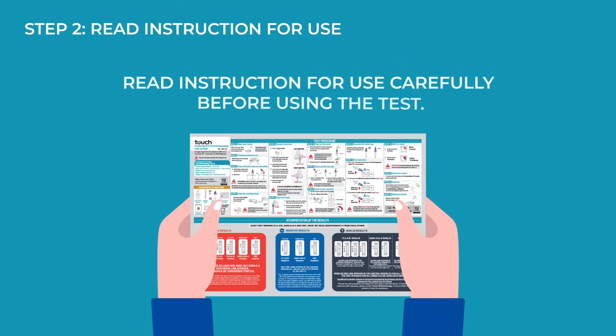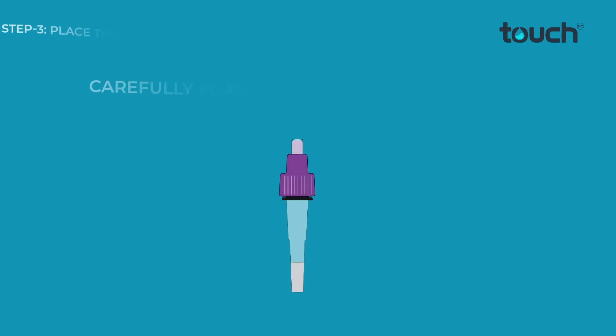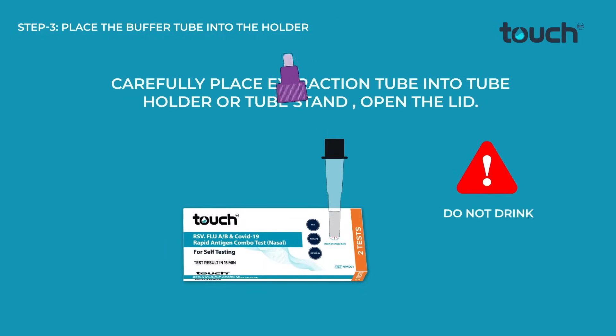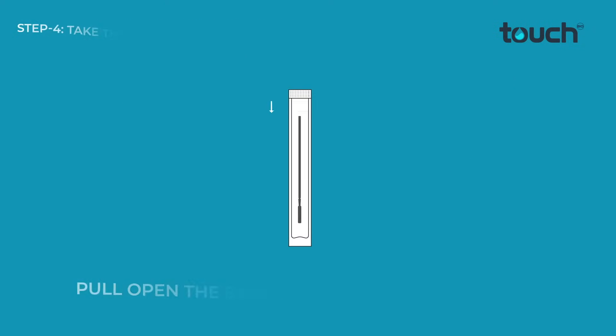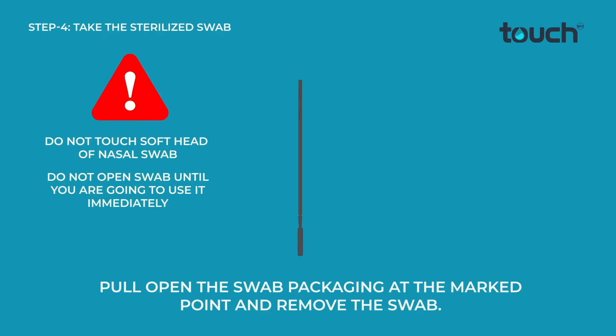Read the instructions for use carefully before using the test. Carefully place the extraction tube into the tube holder or tube stand. Open the lid. Pull open the swab packaging at the marked point and remove the swab.